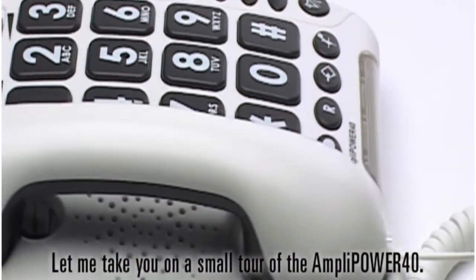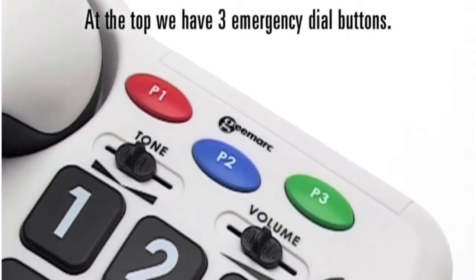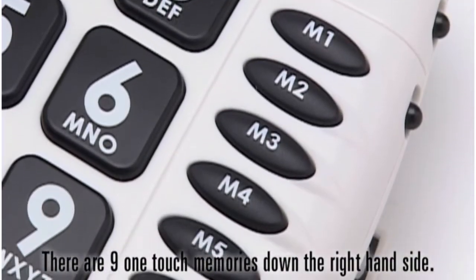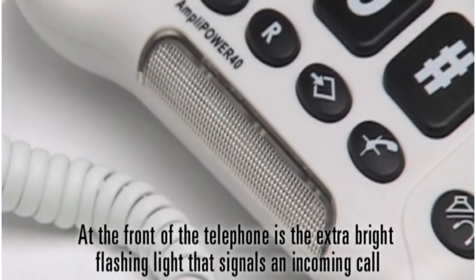Let me take you on a small tour of the AmpliPower 40. At the top we have three emergency dial buttons. You can program these buttons with the emergency number of your choice. There are nine one-touch memories down the right-hand side. The memories will be retained even if the telephone is disconnected. At the front of the telephone is the extra bright flashing light that signals an incoming call.